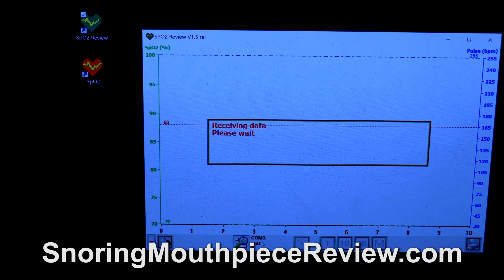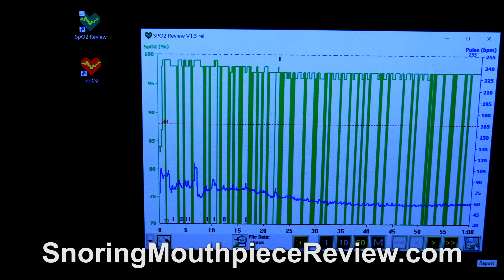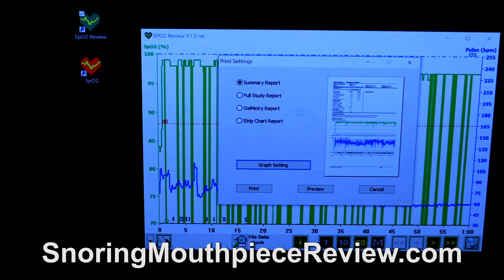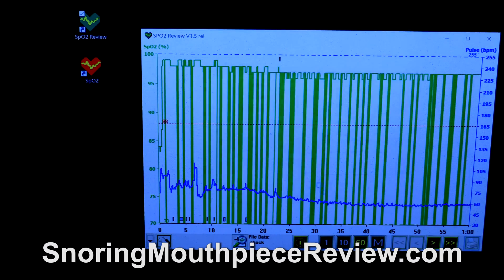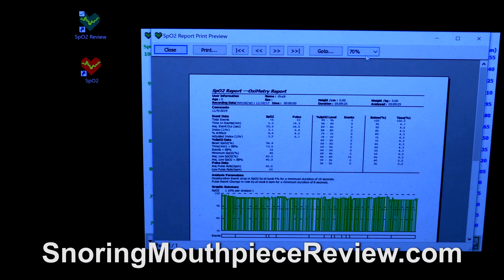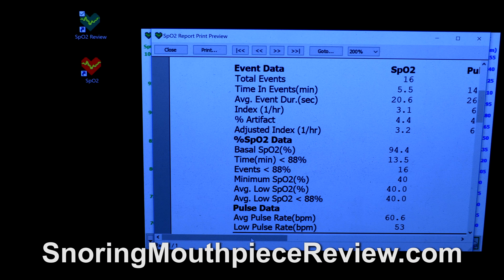This will upload your night's recording to the computer. Once your data has been imported, you can see a visualization of the data. There are various versions which you can save or print. The oximetry report will show you desaturation events, which are a drop in oxygen by 4% for at least 10 seconds. Here you can see the oxygen desaturation index per hour for a patient, also known as ODI.